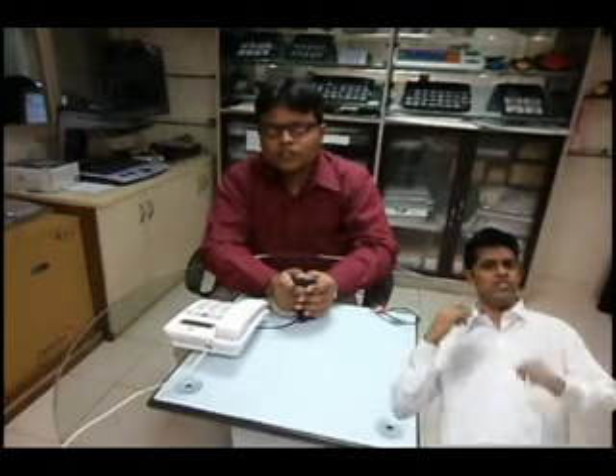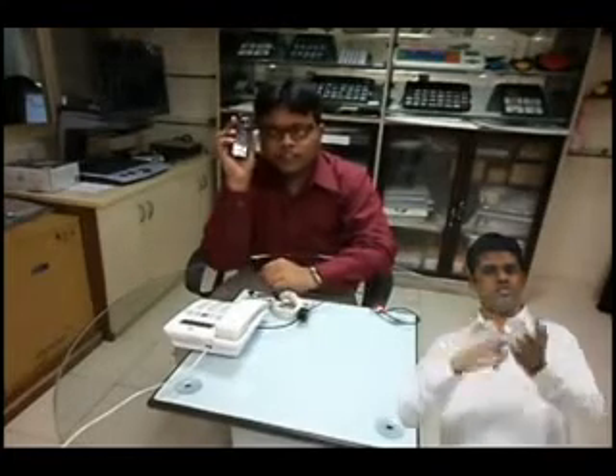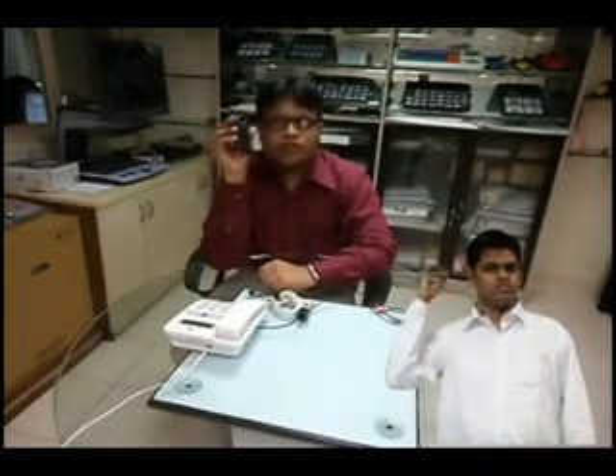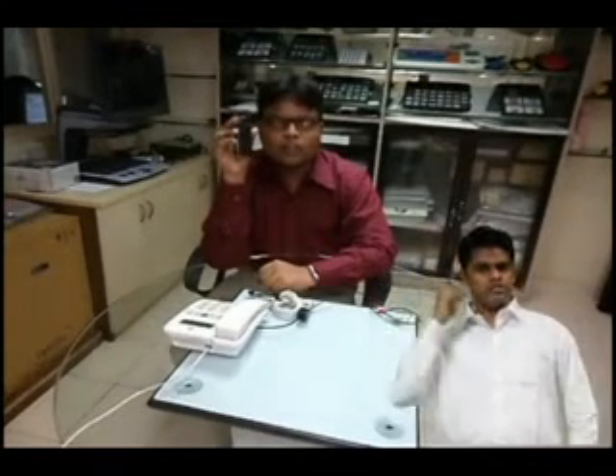Do you find it difficult to hear voices while you are talking on the phone? Hi, I am Amit and this is the Listener Pro. Today I am showing you how you can use the Listener Pro to amplify sounds from your telephone, such that you can listen to the person's voice on the other line with amplification.